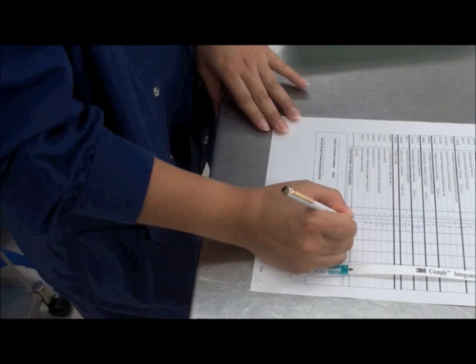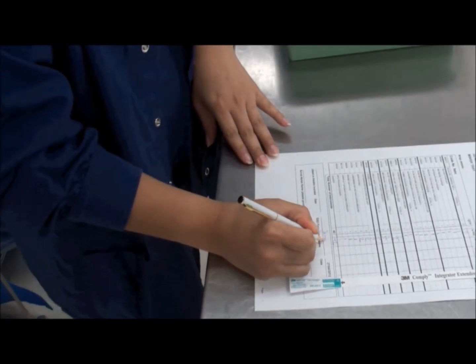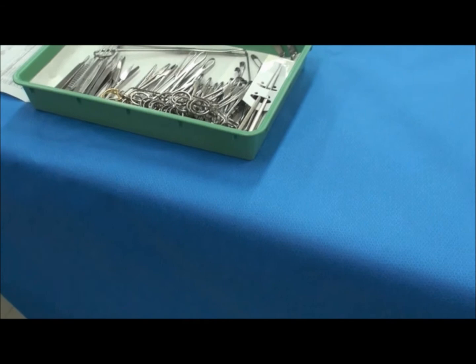Once surgical instruments are checked, the technician validates the surgical instrument traylist by signing the checklist. An internal indicator is attached to the traylist, and the instrument tray is ready for wrapping.